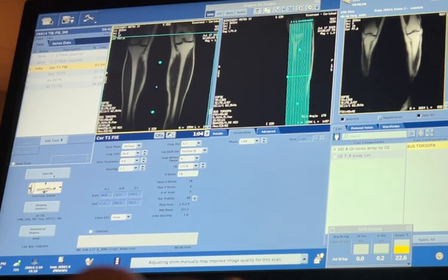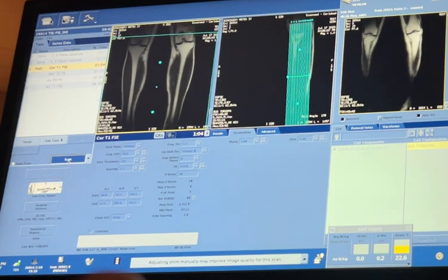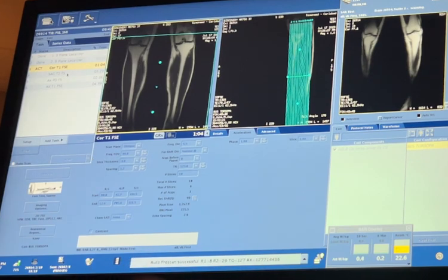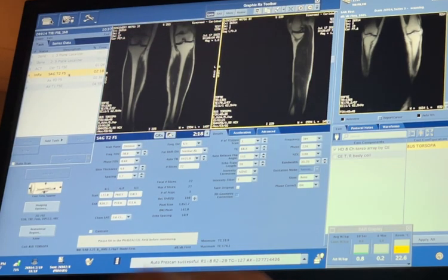Do you ever adjust the phase acceleration? Never. That's a newer thing. I don't even know what that is. I think that's parallel imaging factor, but I don't know. This is a new system, so I actually don't know what that is. My old systems didn't have that, and my Hitachi system that was new probably has this worded totally different. So I don't know.